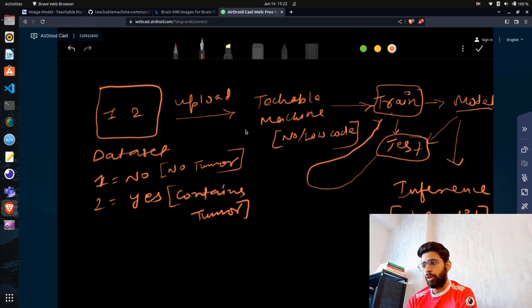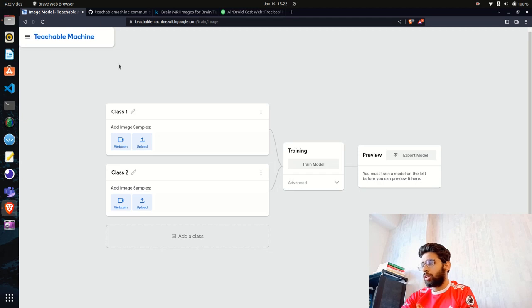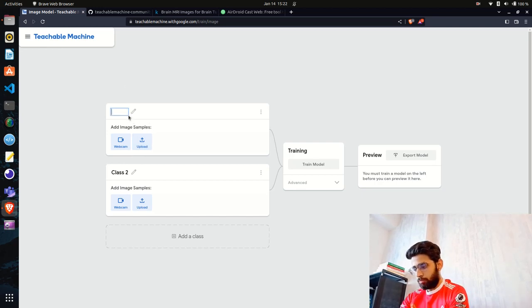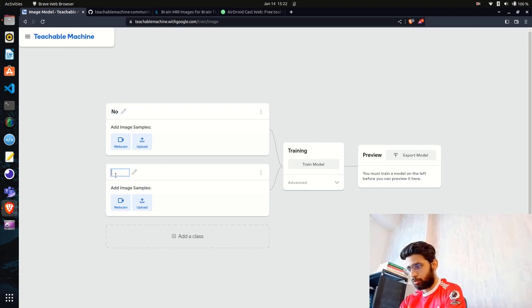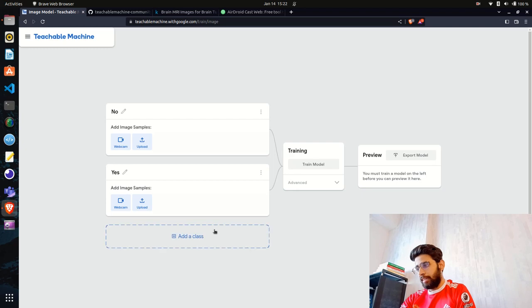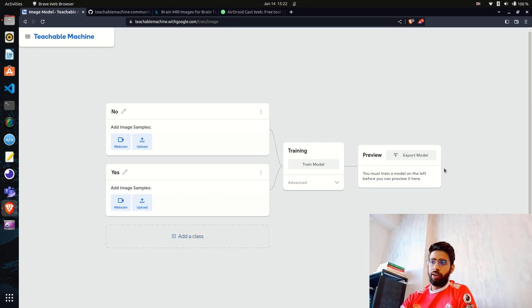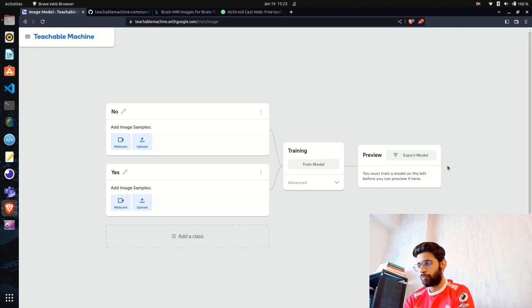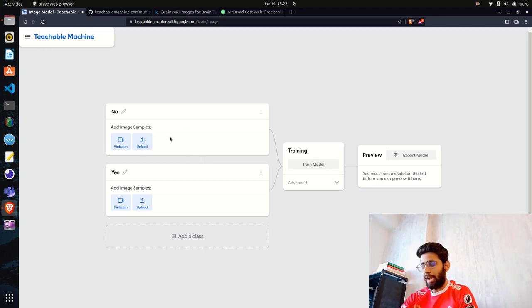Let's get back to the image model we created on Teachable Machine and upload the data. You can rename the class names. I'm going to change Class 1. You can also build a multi-class classification model by adding more classes. There are two options to add image samples: upload from files or capture with your webcam.